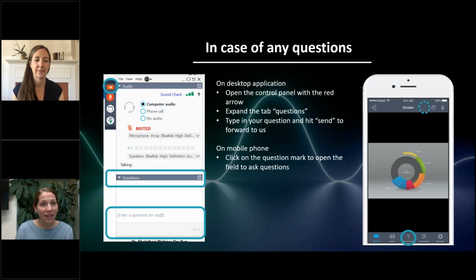The next question is, any plans to compare to VEP? I personally don't have plans to compare to VEP, just from a pure clinical practical perspective. Doing a VEP involves cleaning off the scalp, getting in the hair, putting stuff on people's scalp, which gets in their hair. And so that, if anything, will slow us down in the clinical setting rather than speed us up. So working just around the eye is much more convenient, but I certainly agree it would be an interesting comparative study to do.